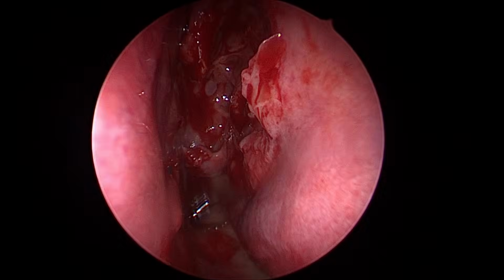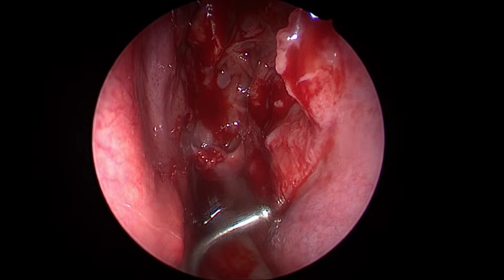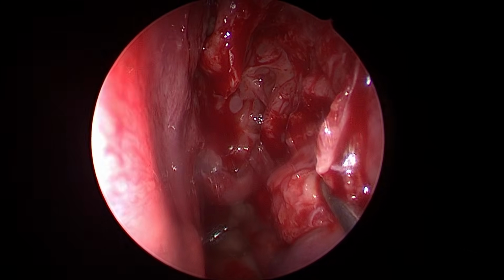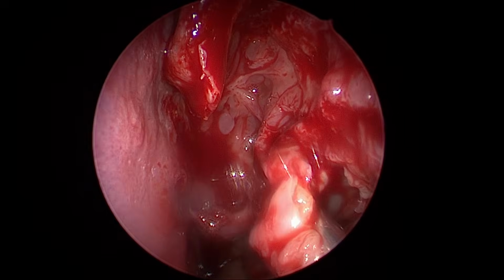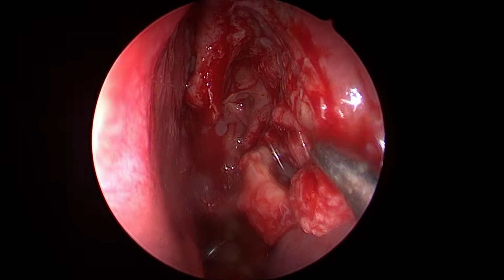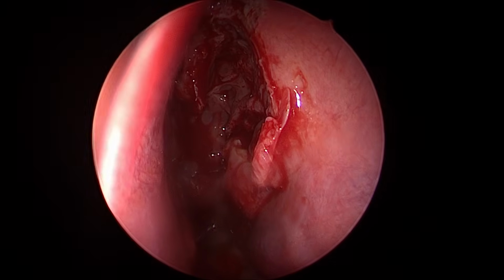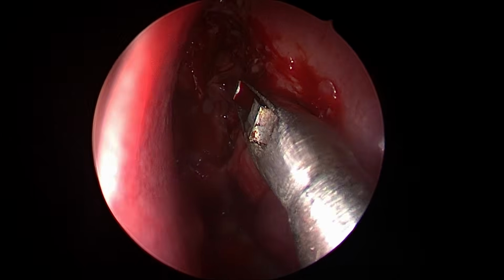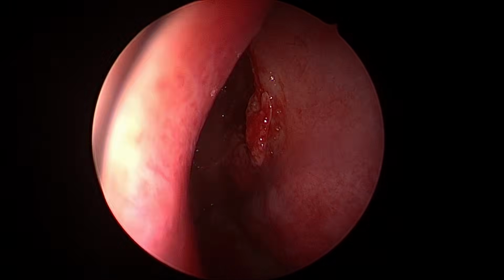Now see where the maxillary sinus is. The ideal location is, this is your inferior turbinate. On the upper surface of the inferior turbinate, if you go laterally and down, this is your maxillary sinus. See this? Full of disease. And this is your remnant uncinate. This is something the previous surgeon has not adequately treated, I would say.